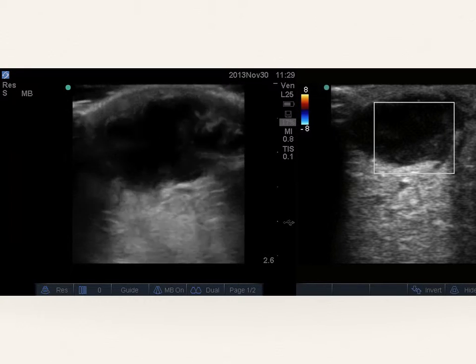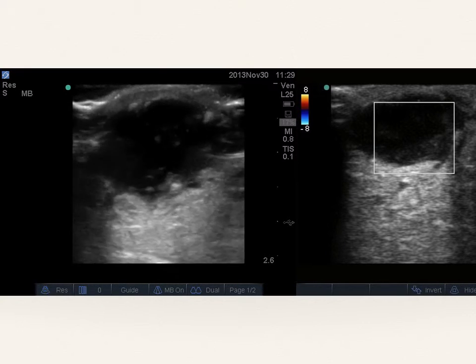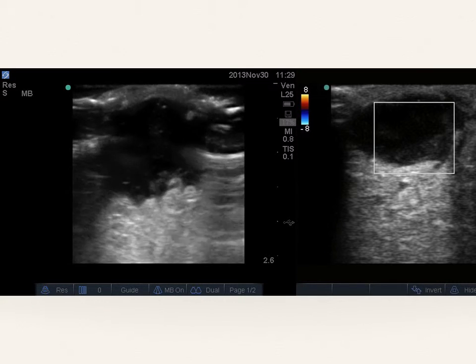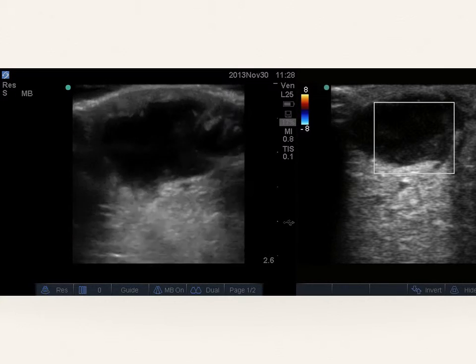Again, if we put this in clinical context, our clinical likelihood was already quite high in this case, even though we didn't have the swirl sign, or at least not shown in the images that I have for you.